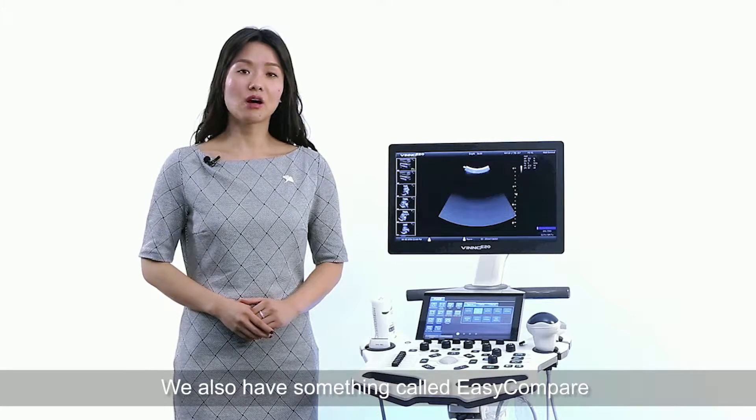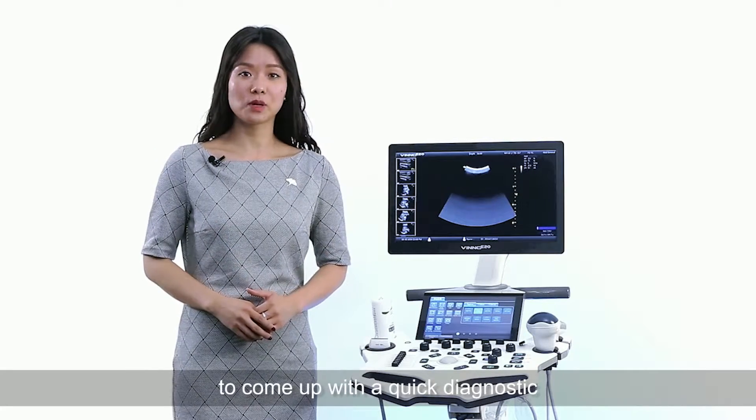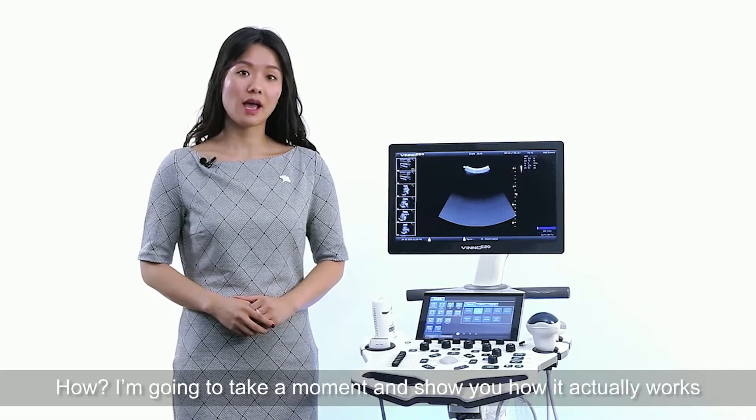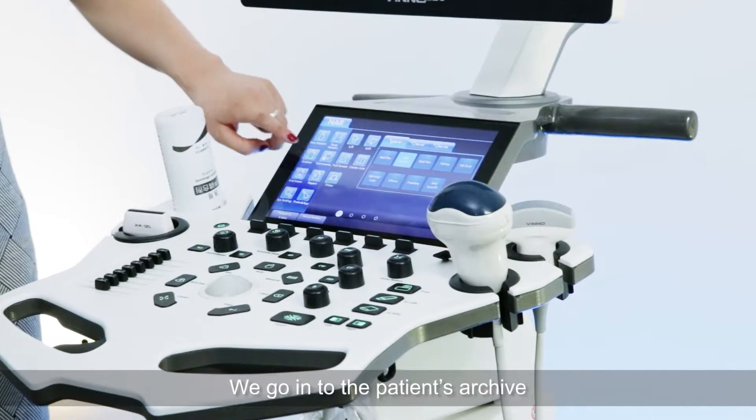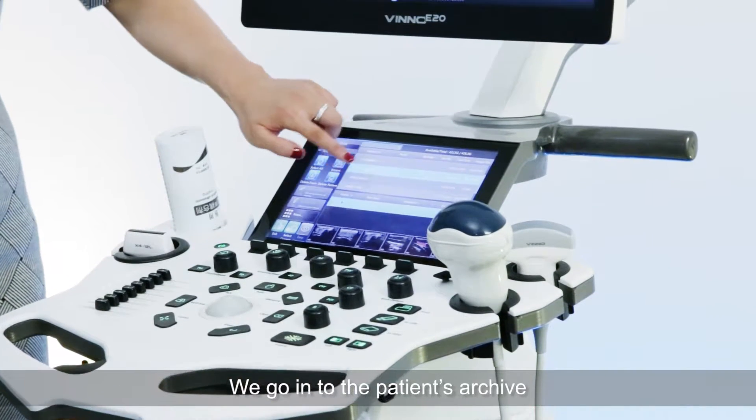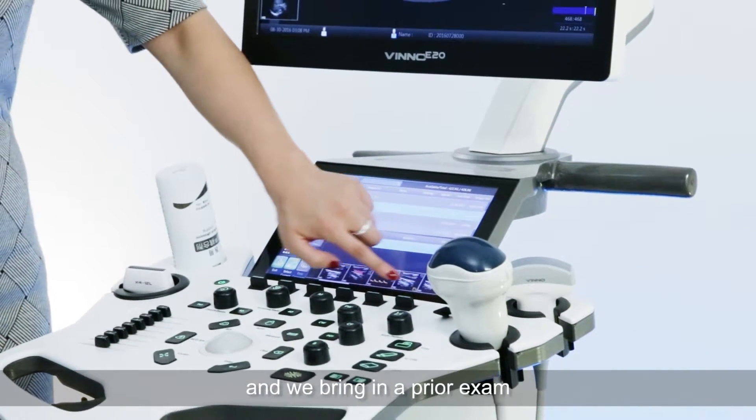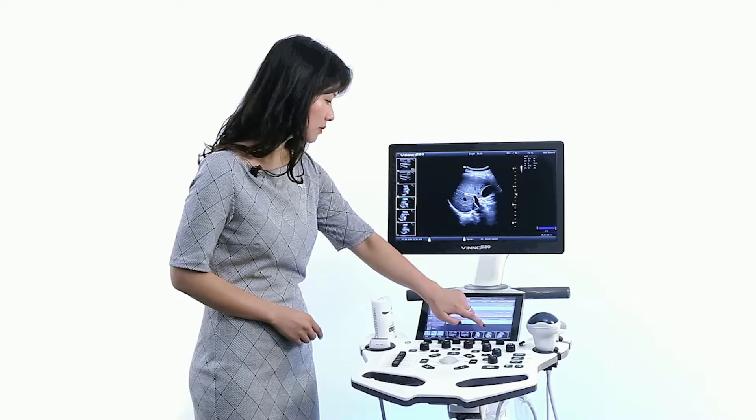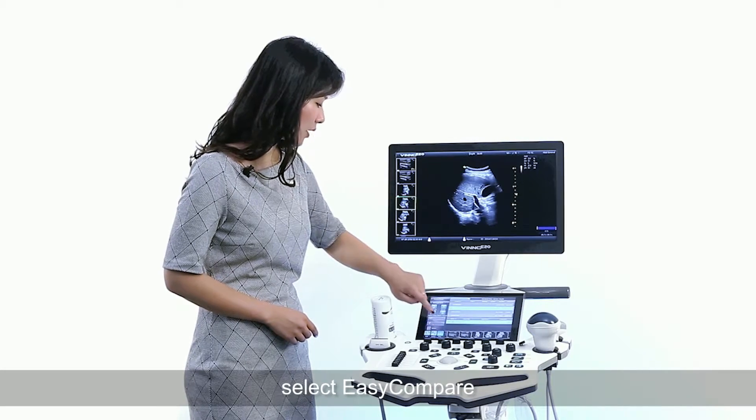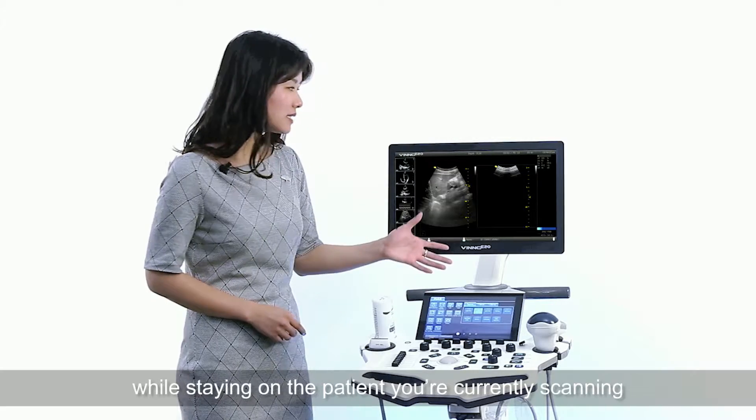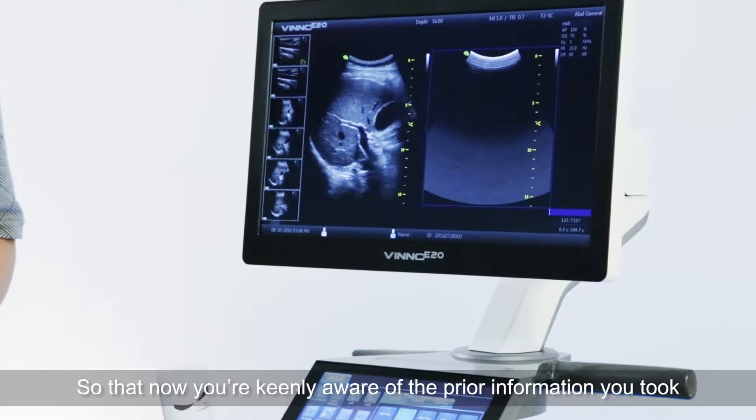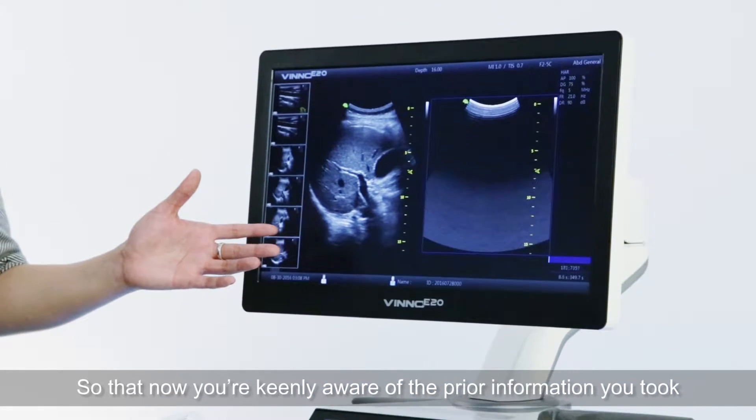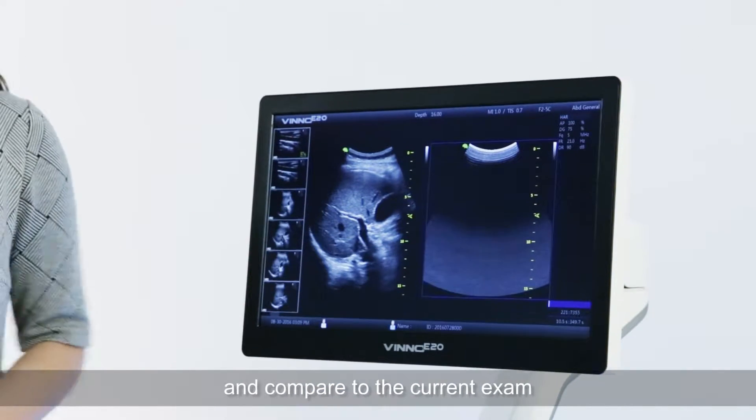We also have something called Easy Compare to come up with a quick diagnosis. I'm going to take a moment and show you how it actually works. We go to the patient's archive and we bring in a prior exam. Select Easy Compare while staying at the patient you are currently scanning, so that now you are keenly aware of the prior information you took and compared to the current exam.